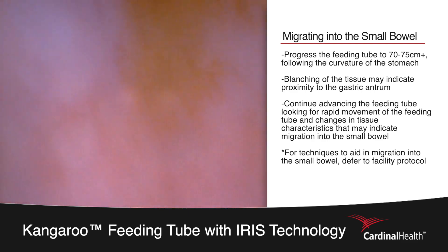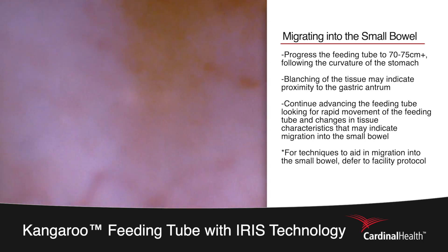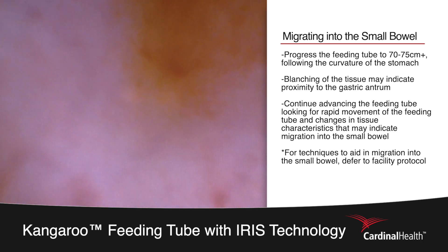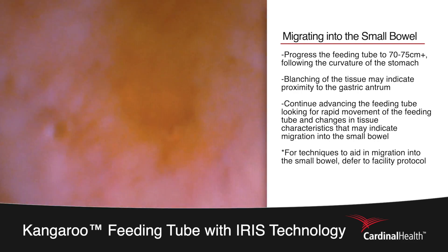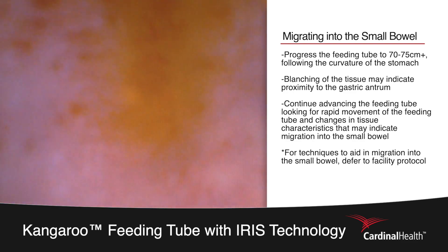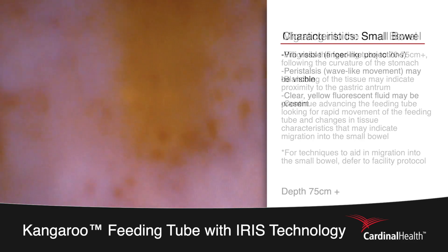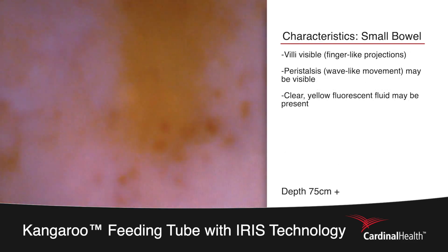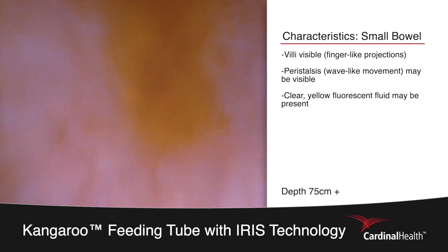We will be looking for the tube to progress into the small bowel, which can be easily seen by rapid movement of the feeding tube — almost popping into the small bowel, as can be seen here. We now see a change in the tissue. The tissue of the small bowel is covered with finger-like projections called villi that will move around the feeding tube in a wave-like fashion.